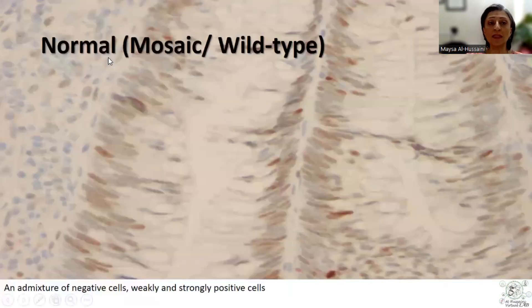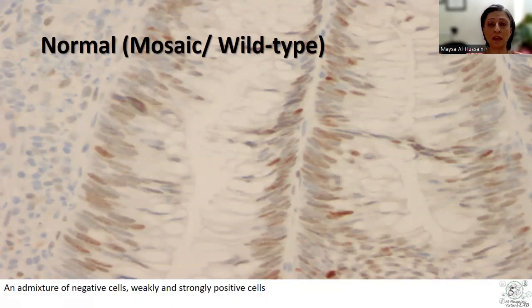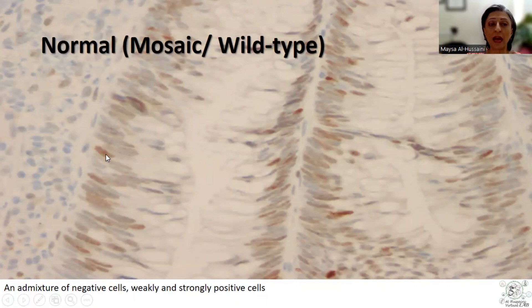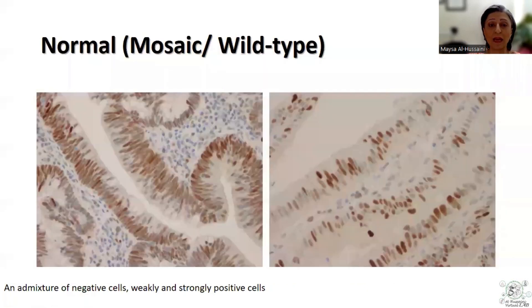This is the normal staining pattern or the wild-type, sometimes referred to as the mosaic staining pattern, in which we see variability of the staining in terms of the percentage of staining cells as well as the intensity of the staining with P53 immunohistochemistry. We have some tumor cells which are negative, others which are positive, and those that are positive show variable intensity — weak, intermediate, and more intense or strong staining. This is the mosaic or wild-type staining pattern, equivalent to normal staining pattern in most instances.